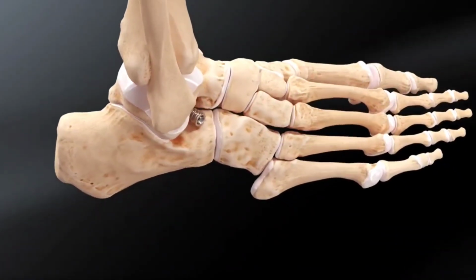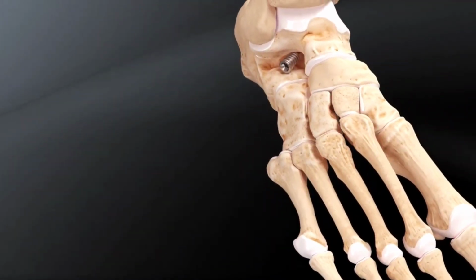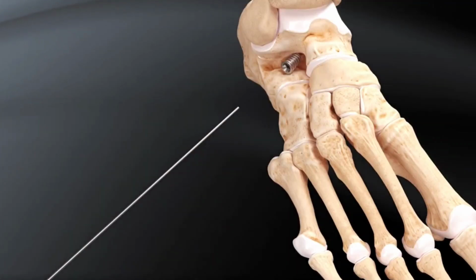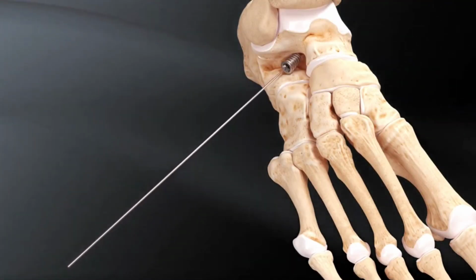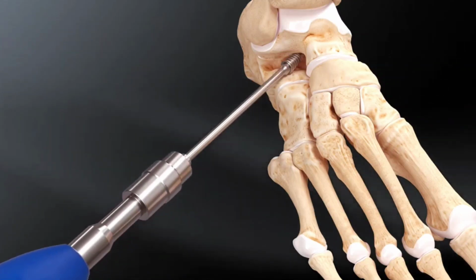If the ProStop subtalar arthroereisis implant needs to be removed, the instrumentation facilitates this procedure. After skin incision and blunt dissection, slide the blunt guide wire into the implant. The funnel-shaped opening helps to locate the cannulation in the implant. Use the driver to unscrew the implant.